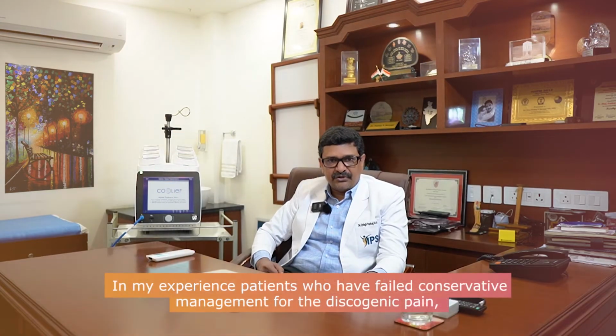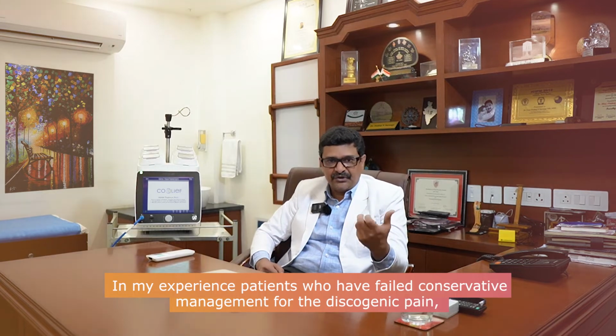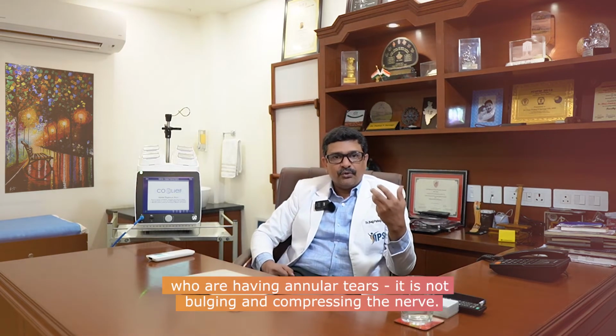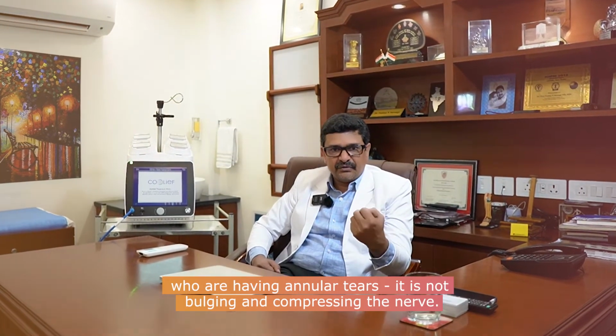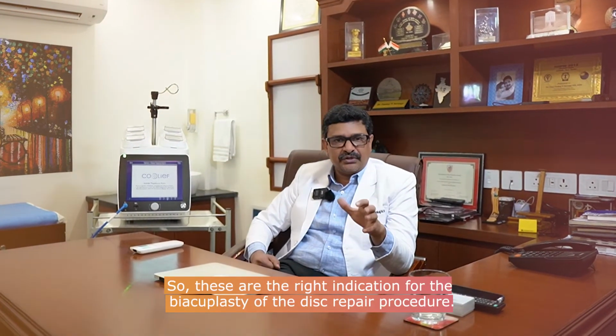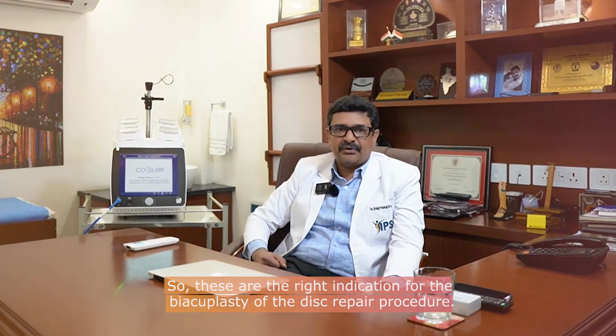In my experience, patients who have failed conservative management for discogenic pain, who have annular tears, where it is not bulging and compressing the nerve, these are the right indication for biacuplasty or the disc repair procedure.